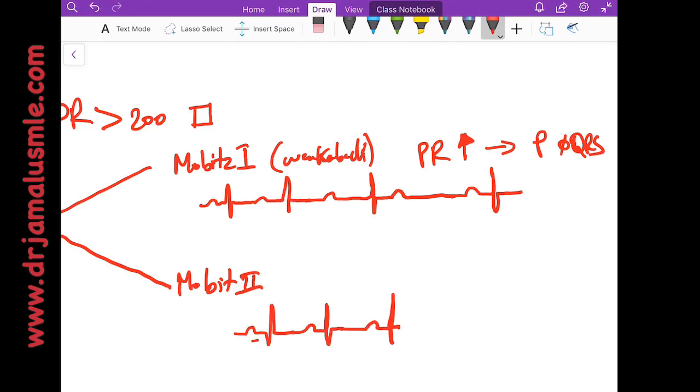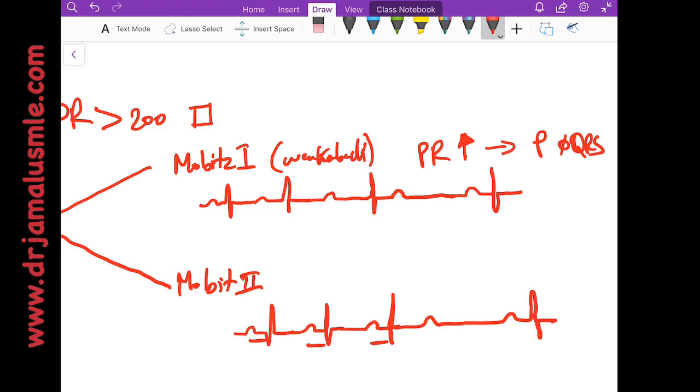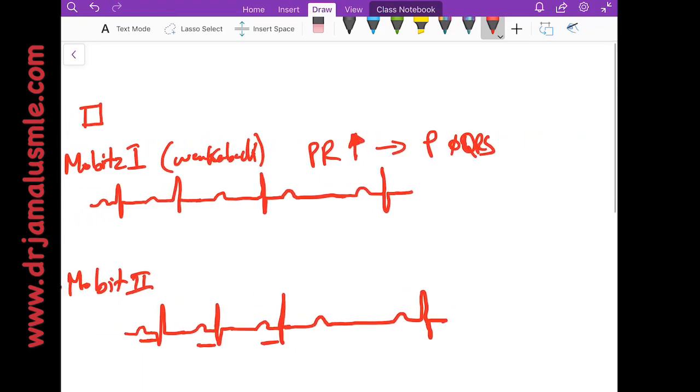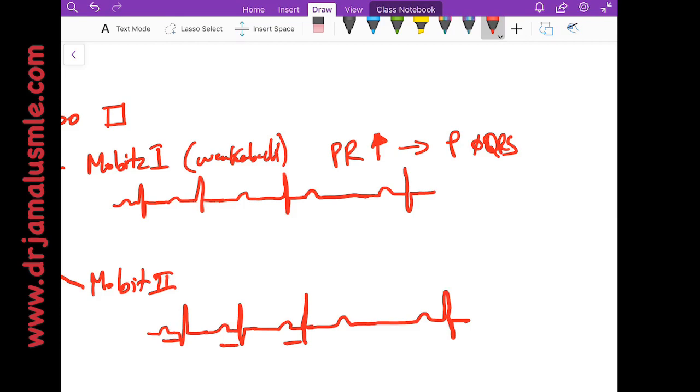Now in Mobitz 2, you can have a prolonged PR but that PR interval stays the same, and then all of a sudden you have a P wave not followed by QRS, and then this pattern continues to return.